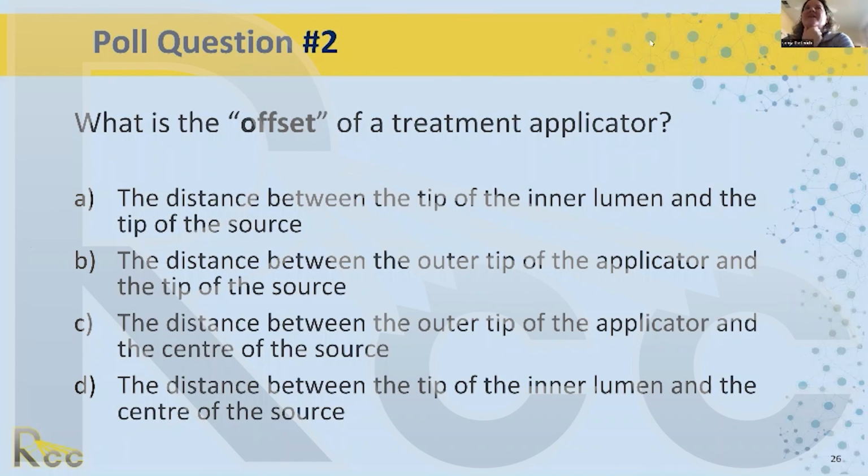If I have existing applicators and new marker wires, I can just do a radiograph and see if that matches the old marker wires. For a completely new system, that is a lot trickier, because what I have done for my new system is I had a technical drawing of the marker wires from the manufacturer, and then I used both a radiograph and a ruler to both geometrically measure it and radiographically measure that the markers were at the correct distance at the tip.